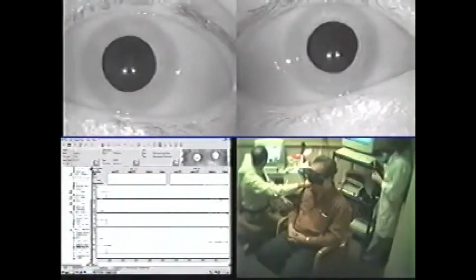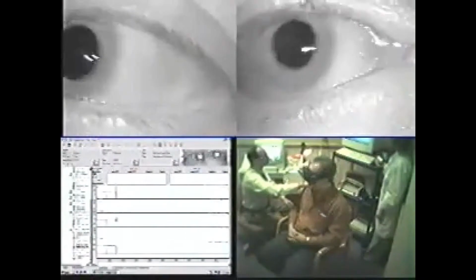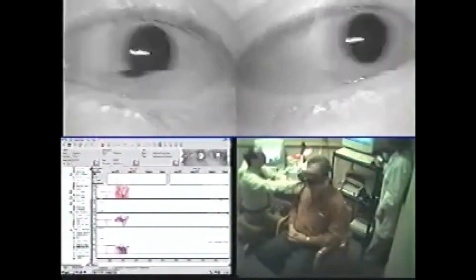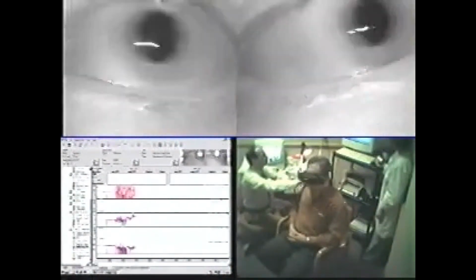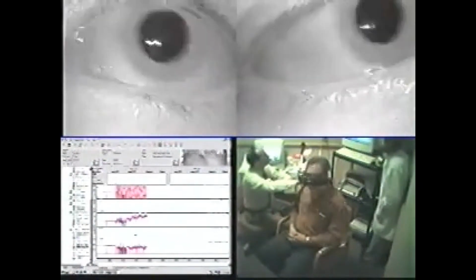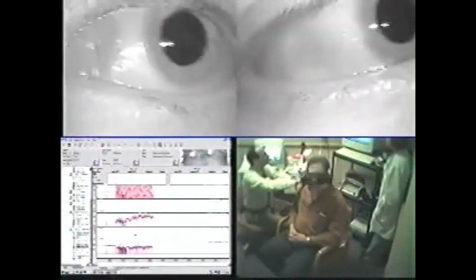The headshake is not about distance. It is rather about speed. So as long as the patient is turning their head at 2 Hz and evenly to the right and the left to stimulate the ears equally, then they do not need to cover any more than 20 to 30 degrees to the left and the right.